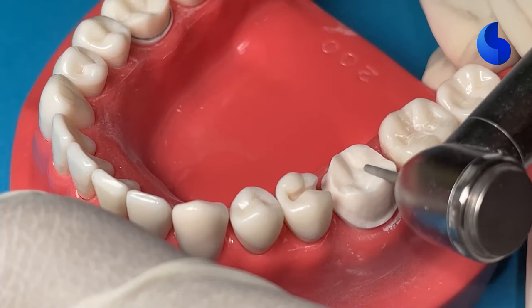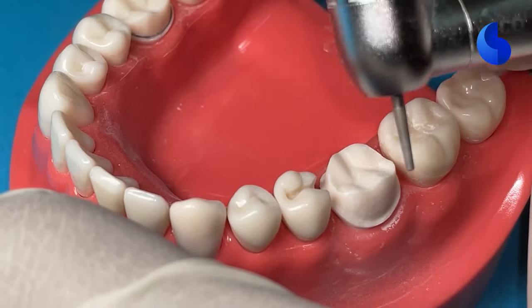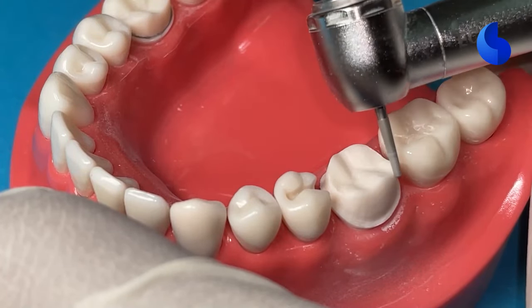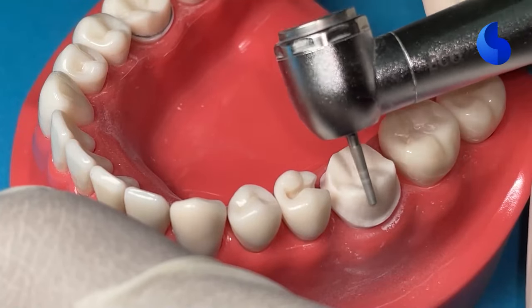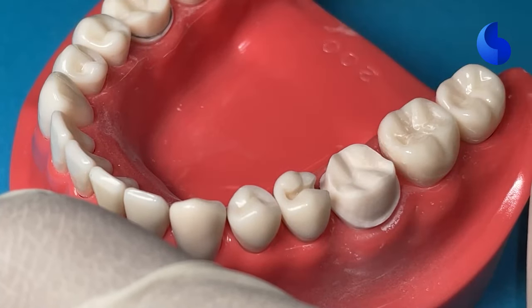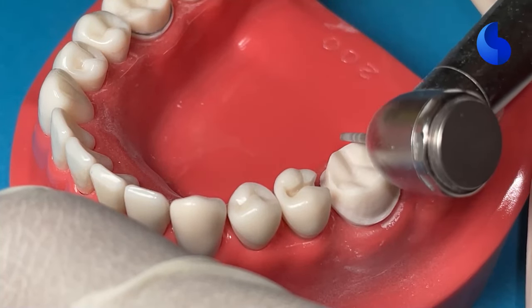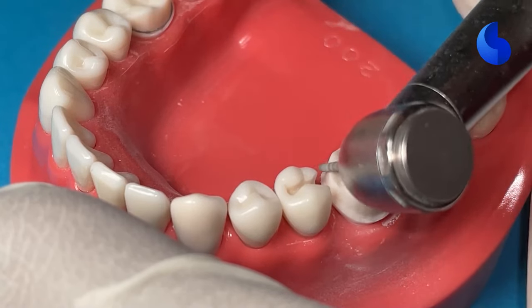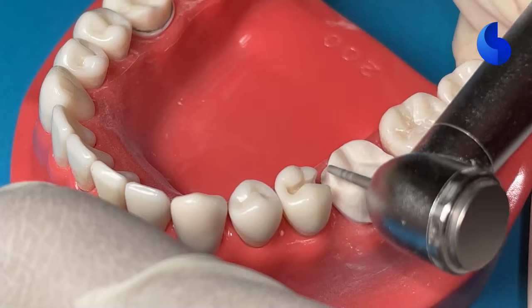After you've smoothened out all the axial surfaces and the occlusal surfaces, you can now go back and re-establish the functional cusp bevel that you placed when you started preparing your tooth structure. And you can now do this with this finishing burr. Another burr that's great is a carbide burr, a football burr, which you can also use. And also do the same thing on the lingual cusp, just to remove the sharp edges.